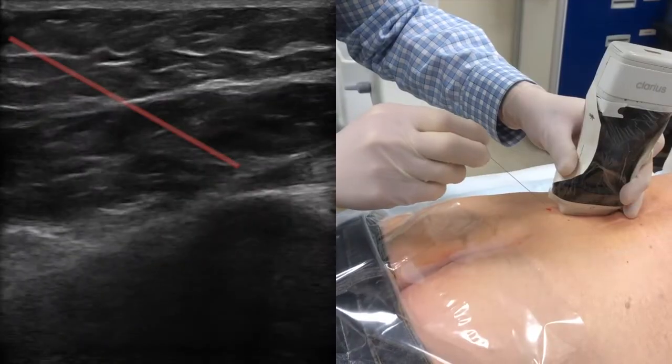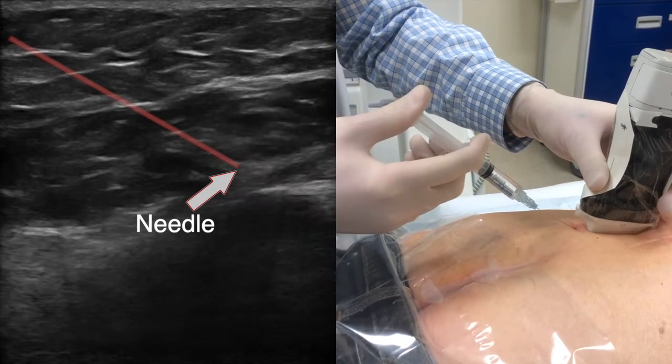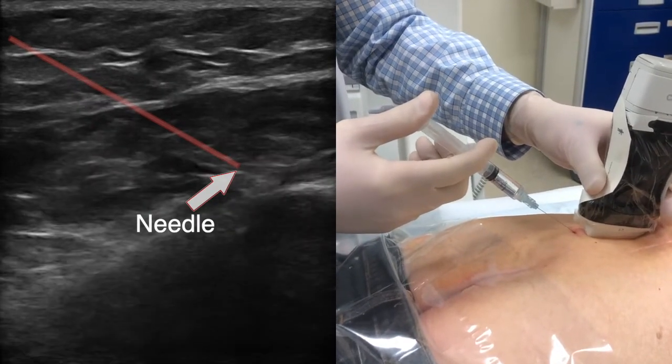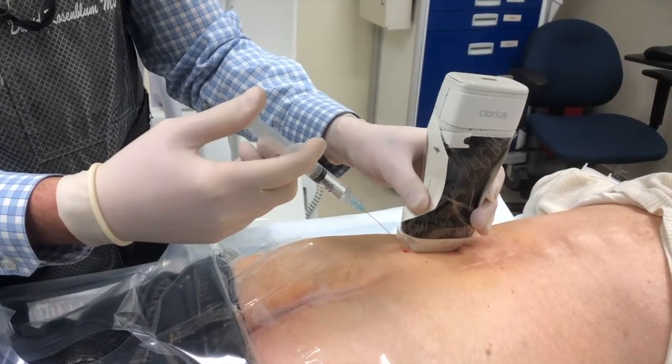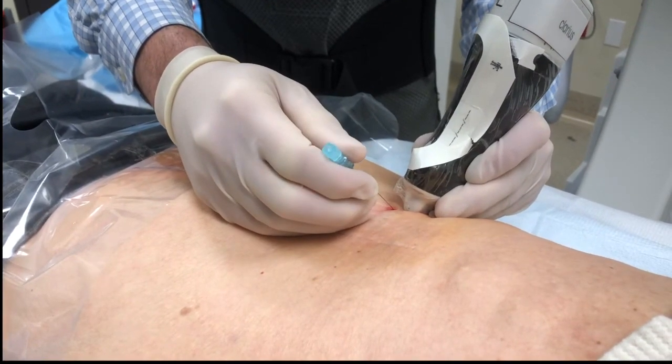This is a patient who originally had a sacroiliac joint injection as well as gluteal trigger point and subgluteal bursa injections without any long-term relief. On exam, she did have a positive Tinel's sign near the iliac crest, right where my needle is and where I'm working.